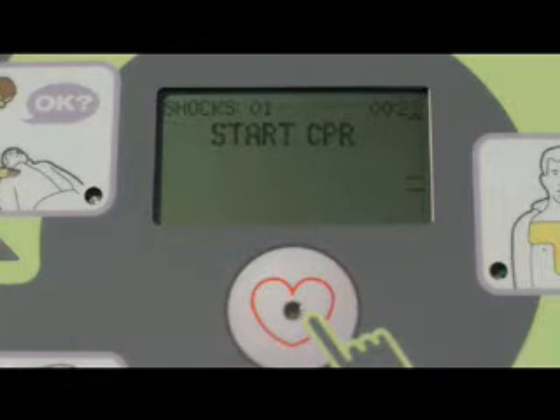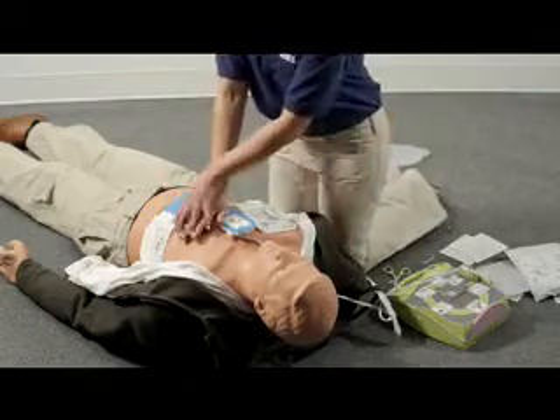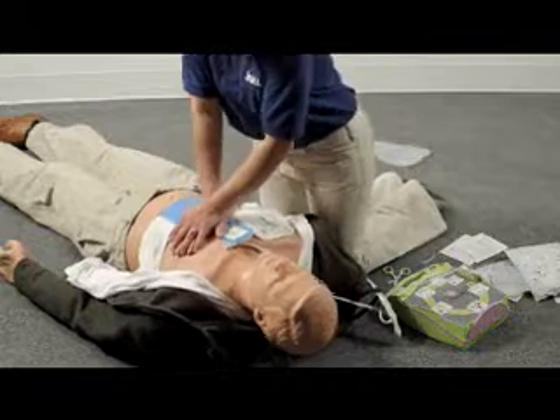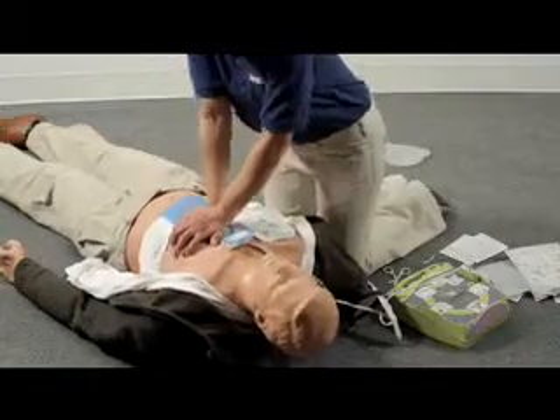After the shock, immediately start CPR. Do your compressions by pushing down on the CPR landmark. If your compressions aren't at least 2 inches deep, the AED Plus will let you know. The AED will alert you every 15 seconds if you don't reach the target CPR depth.